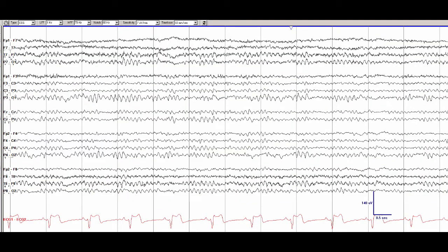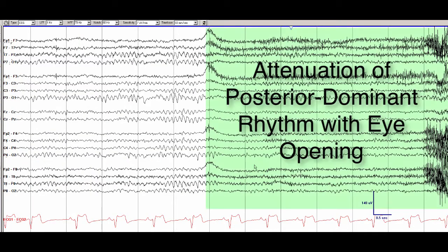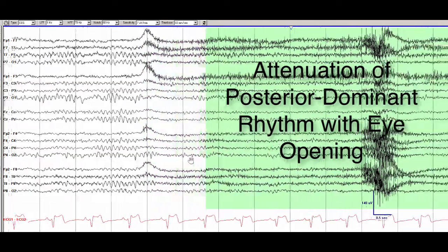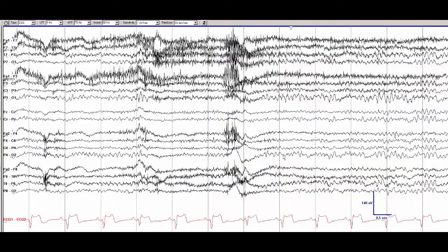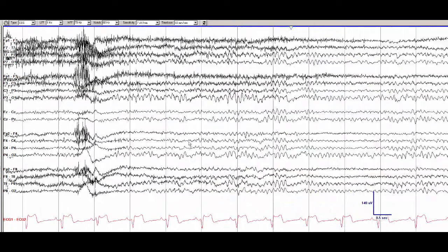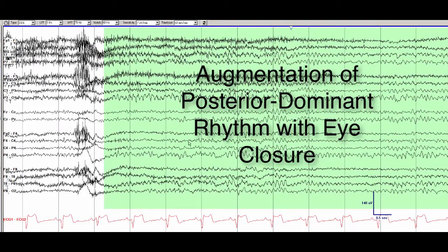If we move forward we can see attenuation of the posterior dominant rhythm with eye opening and then augmentation of the posterior dominant rhythm with eye closure. So far this patient has a normal awake rhythm.